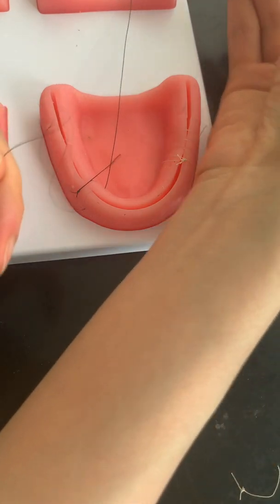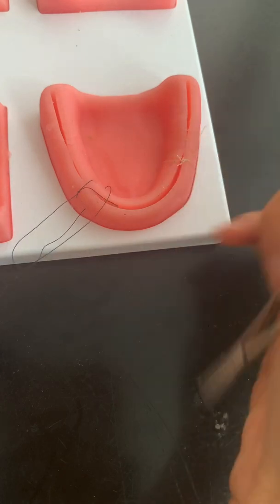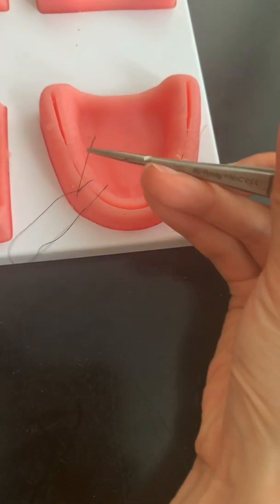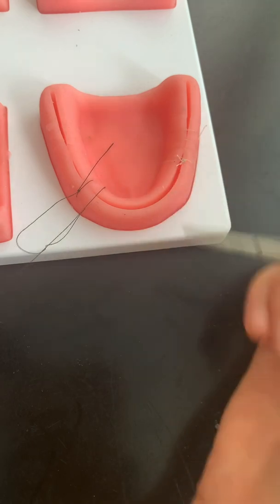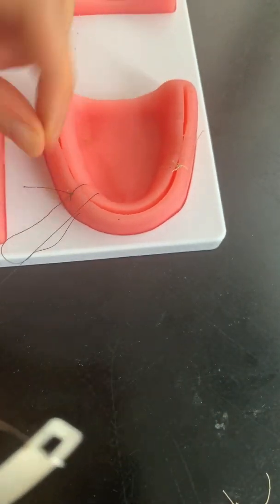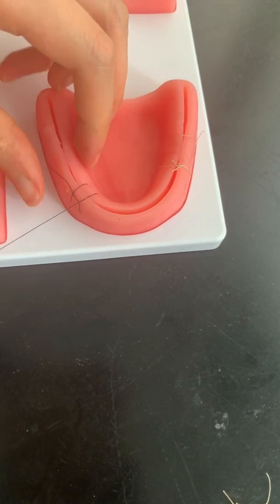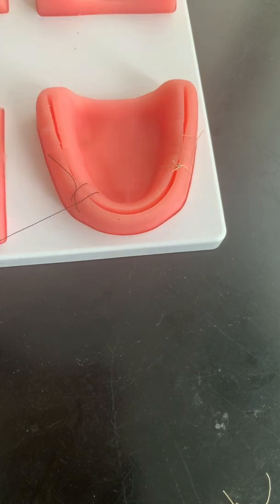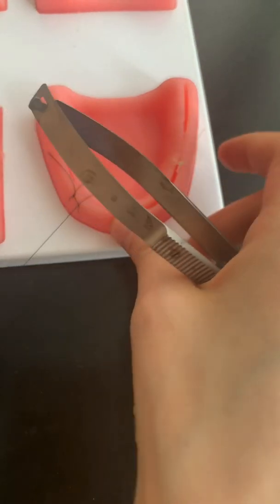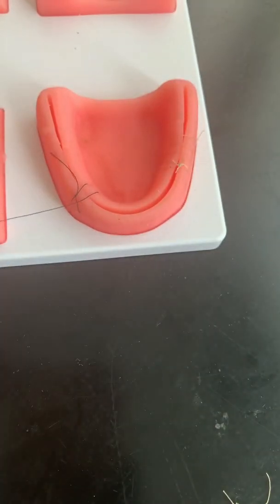It's getting caught on everything because my string is so long. It's pretty easier if you cut it shorter. You want to keep this tight — always hold it with your hand and keep this tight as you continue, because it gets loosened up if you don't.